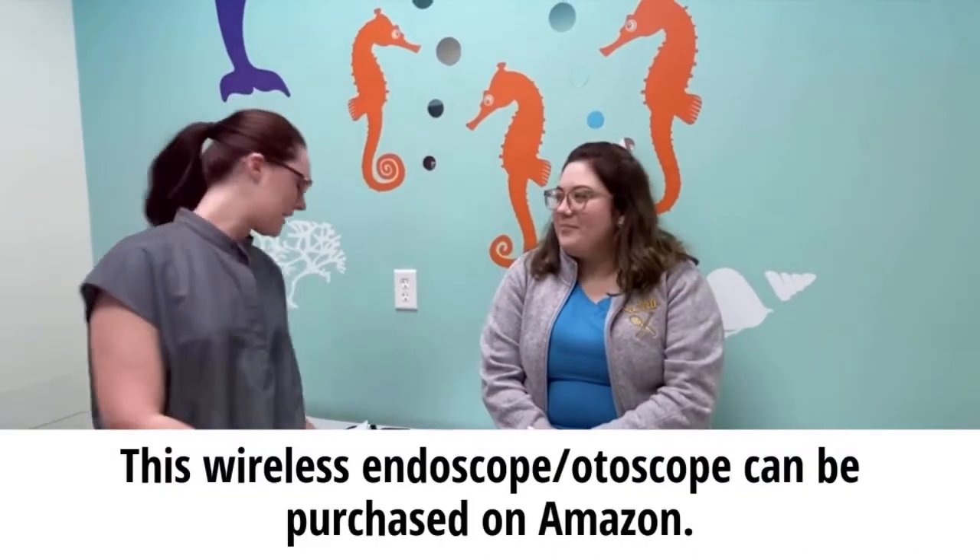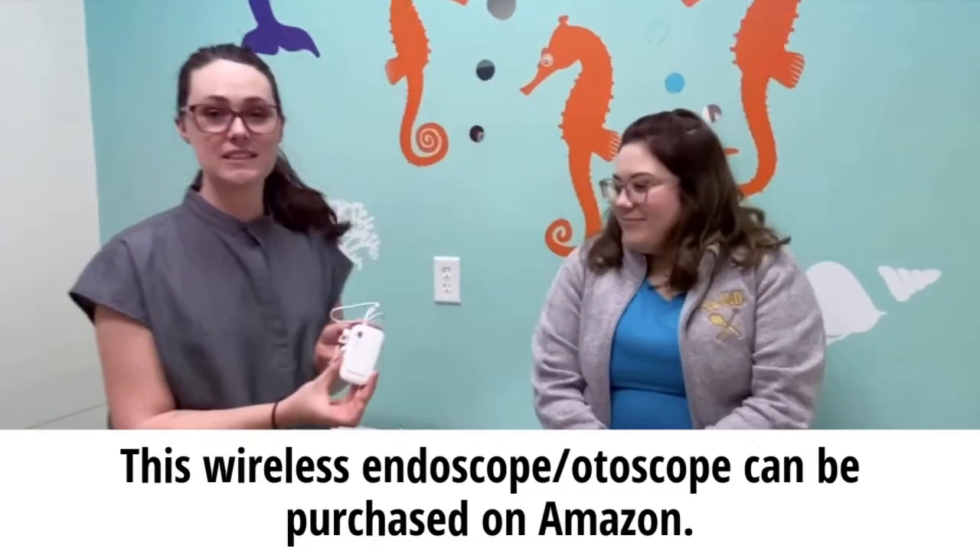Hi there, my name is Marie and I'm Samantha and today we're going to be teaching you how to use the Teslog Endoscope.